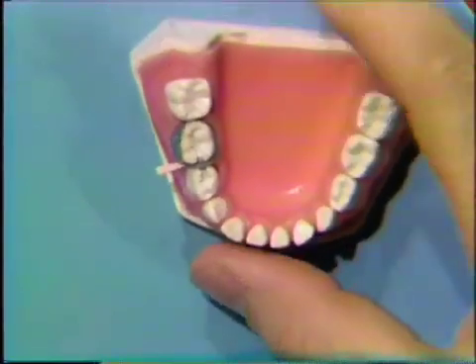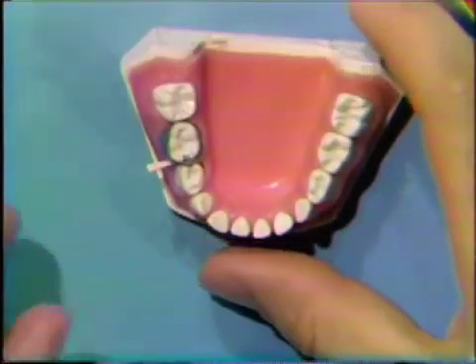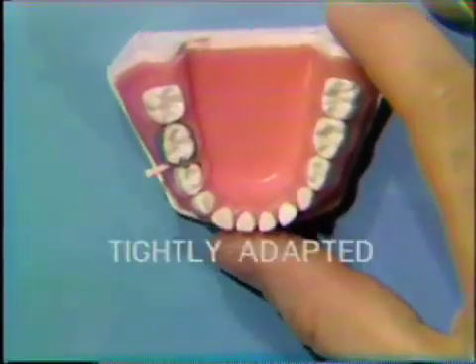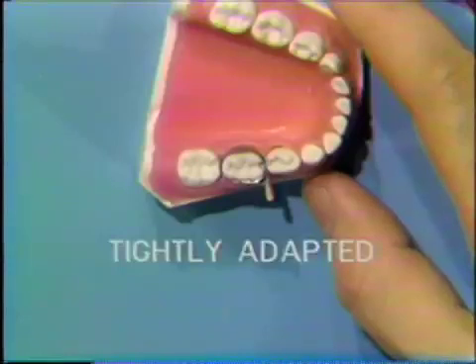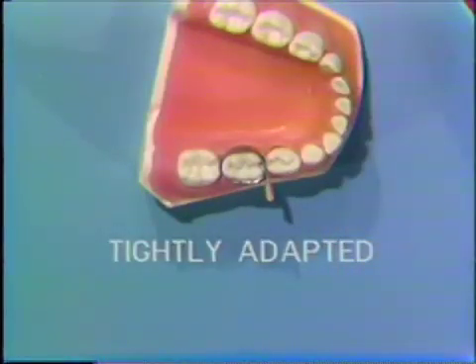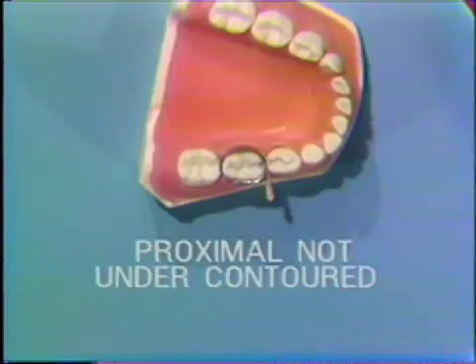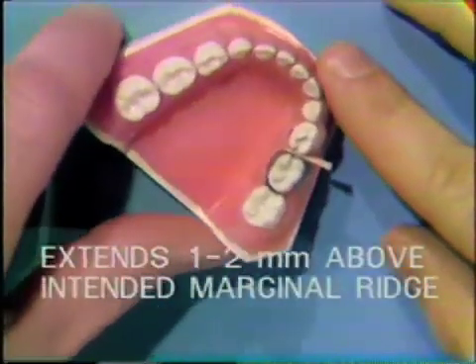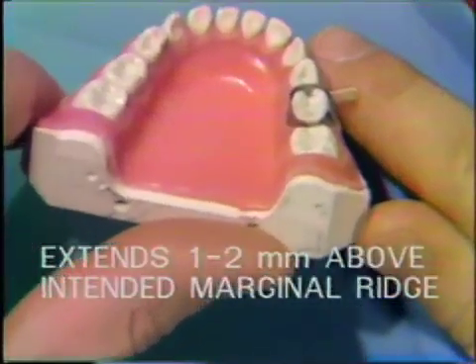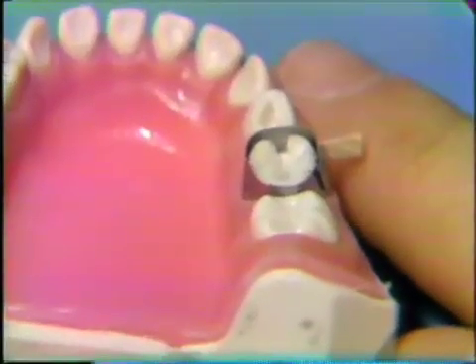Now the matrix band is completed. Let's review the criteria to determine if the band is satisfactory to continue placement of the restoration. The band should be tightly adapted — not only around the tooth, but at the cervical — and the final adaptation should be with the wedge, wedging the cervical of the band against the prepared proximal box. The band should not be over-contoured, and similarly it should not be under-contoured. The band should extend about a millimeter or two above the height of the intended marginal ridge, to give us packing convenience and also so that we can remove the band with the greatest amount of ease.